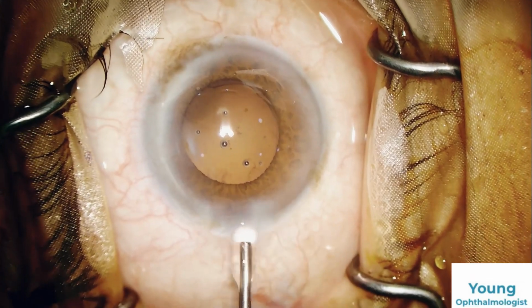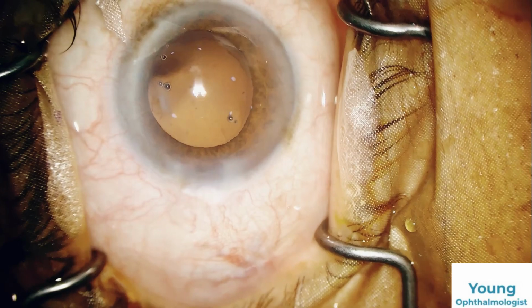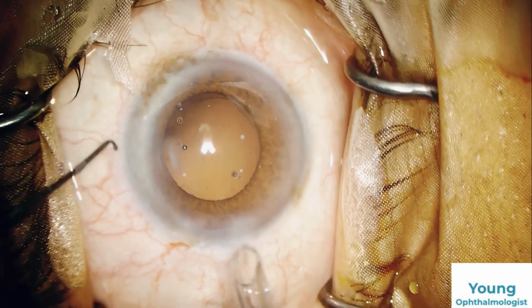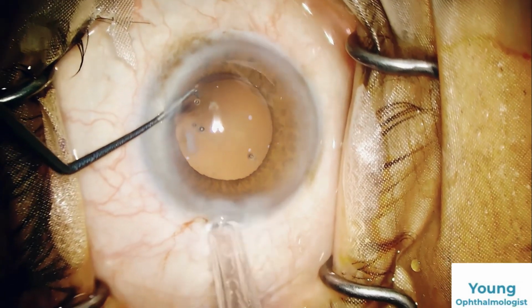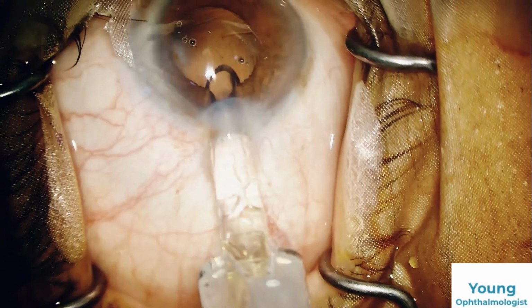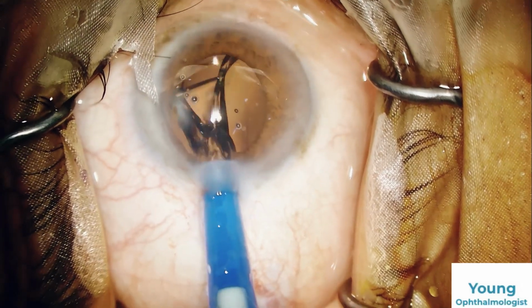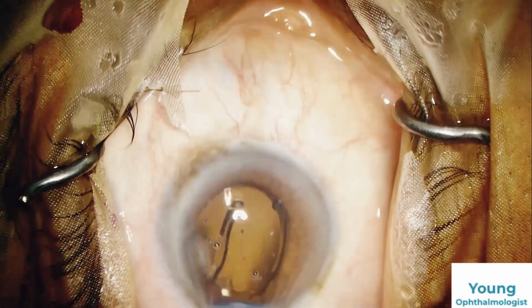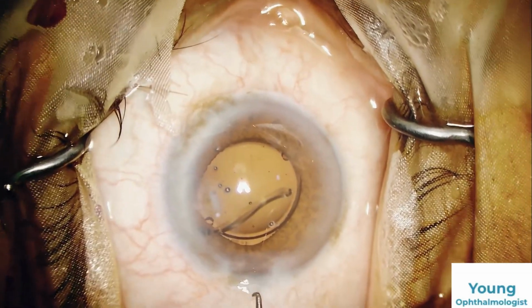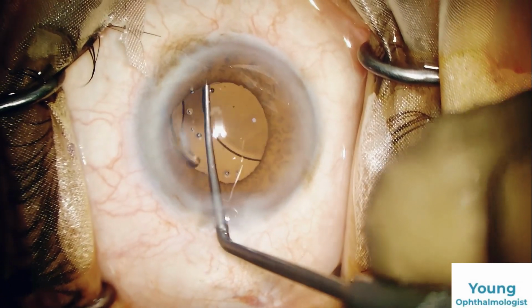Now it's time to put the lens. Visco is injected, HPMC 2%. Here we are using Care Group Magnificent lens, an advanced monofocal lens. The lens is pushed inside the eye. One haptic is in the back. The other haptic will be pushed inside the bag.